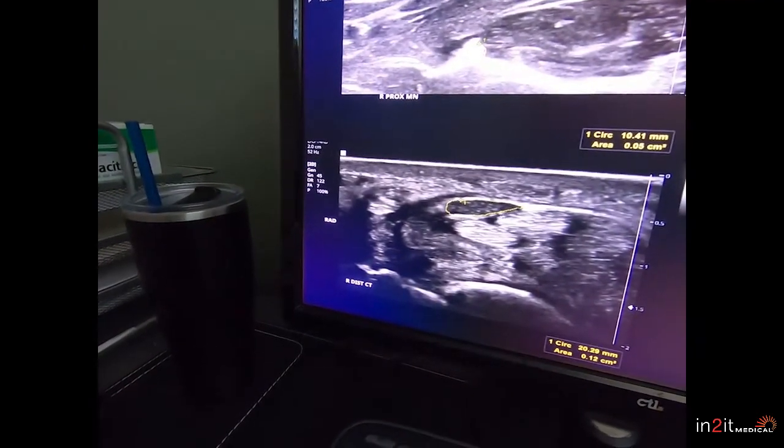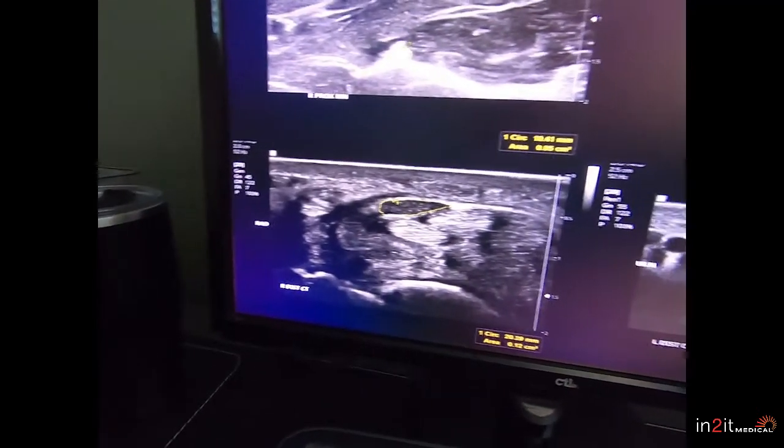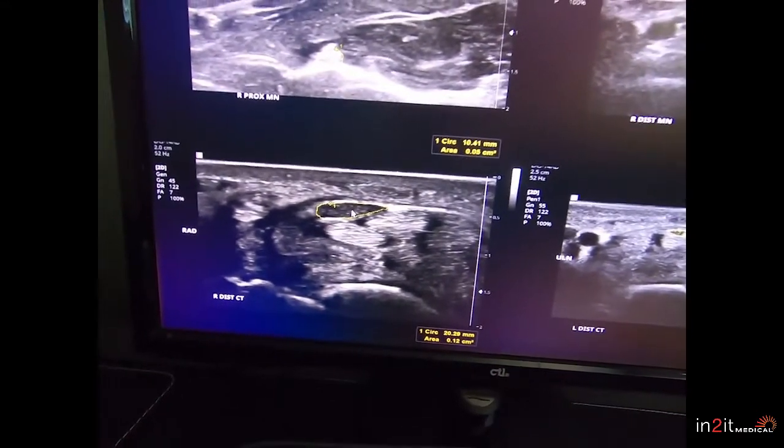And then this wrist — we can see that it changes shape as it goes down the wrist. This one's 12 millimeters squared. This is pretty typical for carpal tunnel syndrome and a pretty easy one to see.